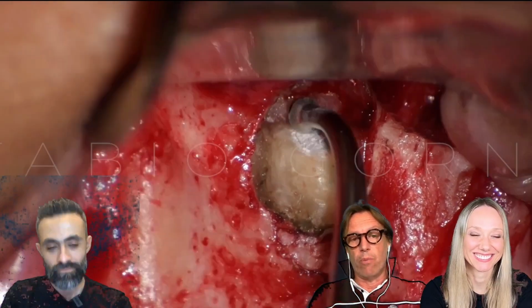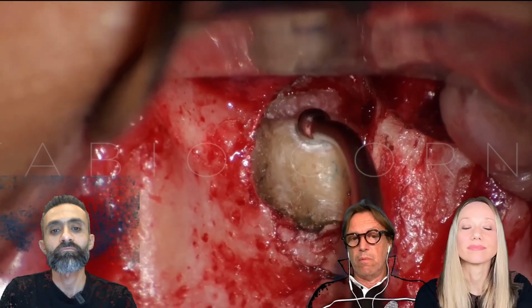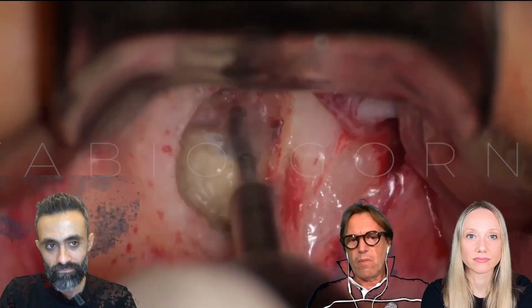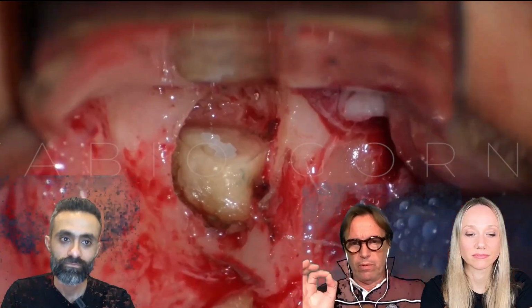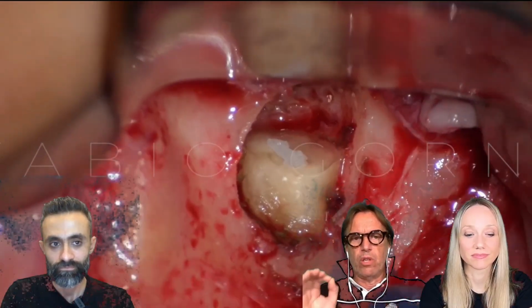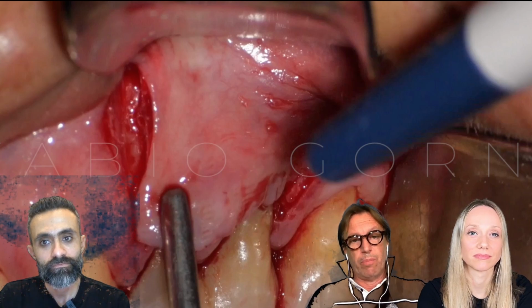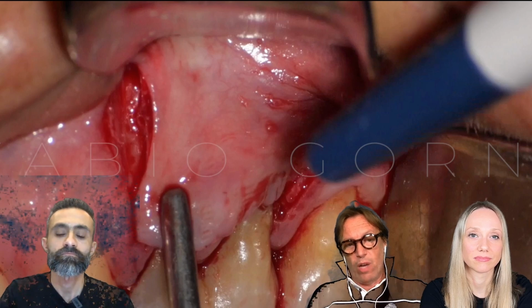It's much easier to use Super EBA compared to other materials. For example, in this case the bleeding control is perfect, but not all the time is it possible to reach this kind of control, and when it's not possible, just a drop of blood and we are in trouble using bioceramic putty or MTA, and sometimes we have to restart the surgery completely from the beginning.